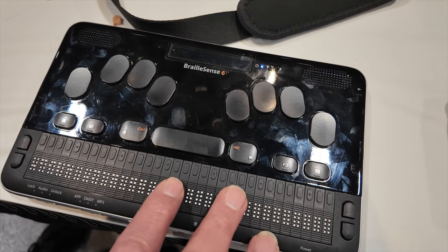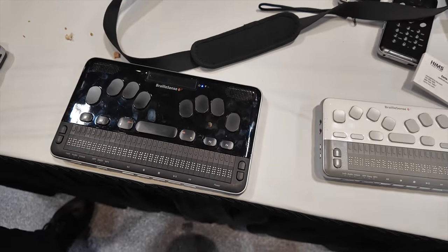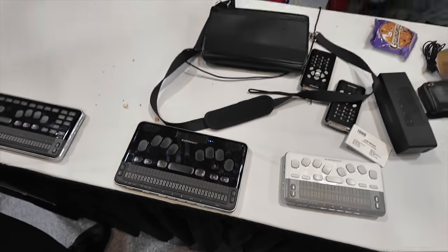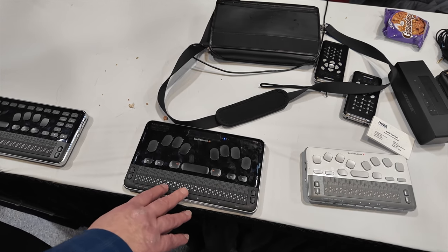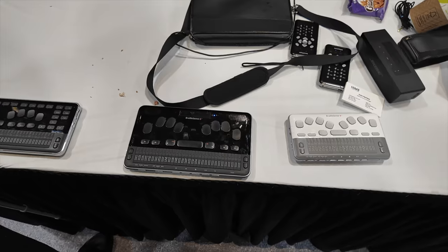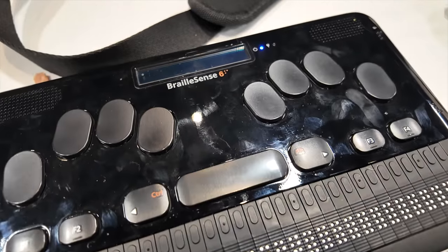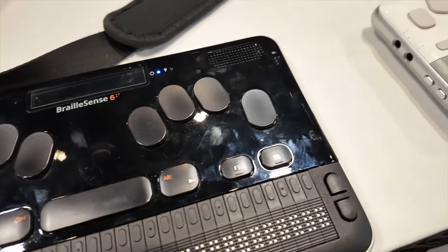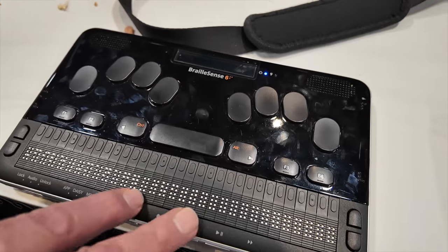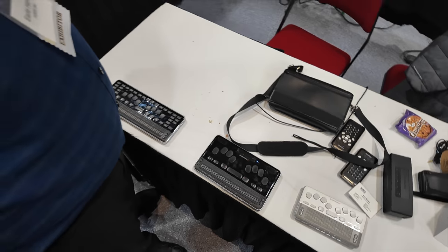Okay, so I see file manager. And it talks at the same time. So think of this BrailleSense 6 as kind of the way you would think of a tablet, like an iPad or a Google tablet. I can do all the same types of things on it as you can on that. The differences are I get both speech and Braille output, and I also have apps developed that help to streamline productivity and workflow.